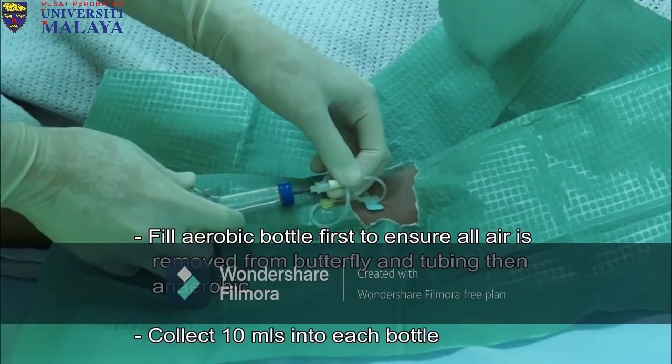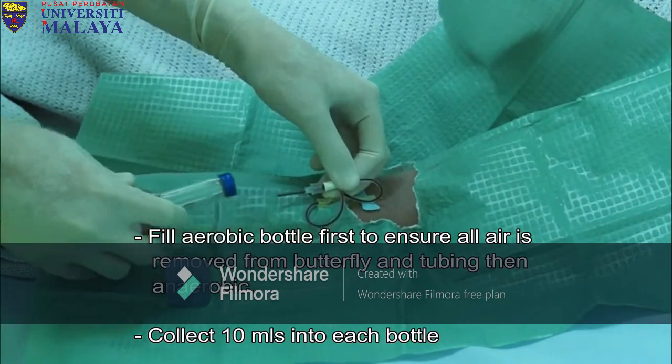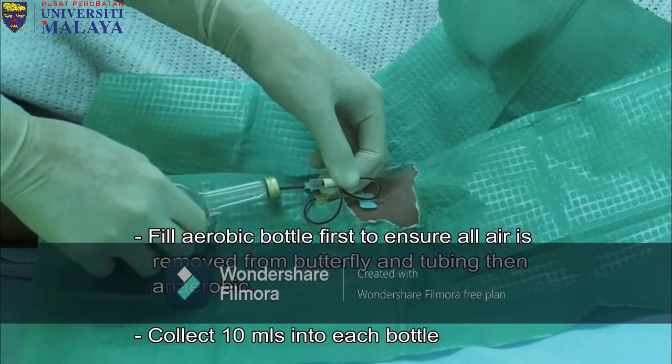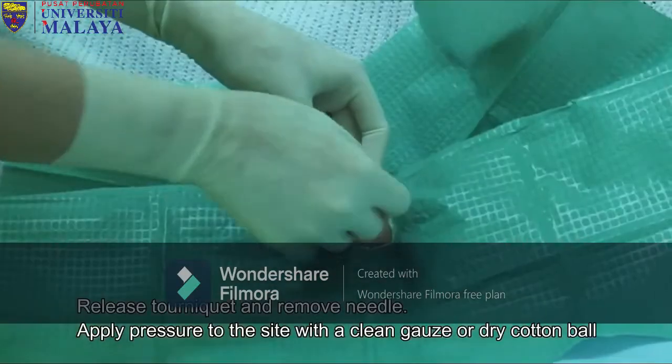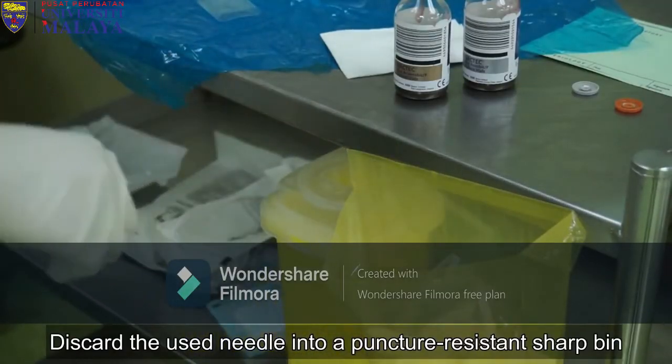Fill the aerobic bottle first to ensure all air is removed from the butterfly and tubing, then followed by anaerobic. Collect 10 ml into each bottle. Release the tourniquet and remove the needle. Discard the used needle into the sharps container.